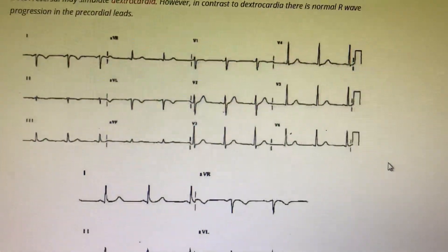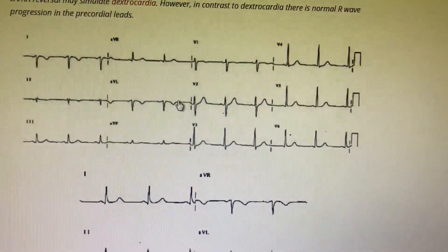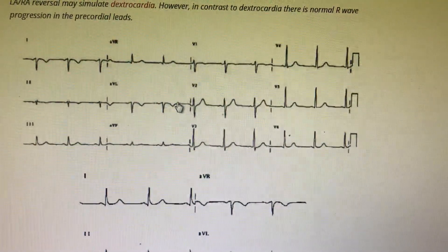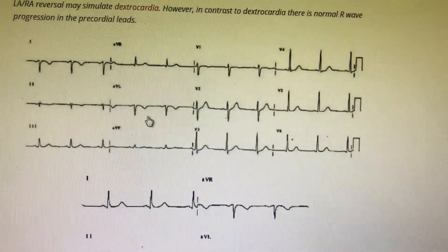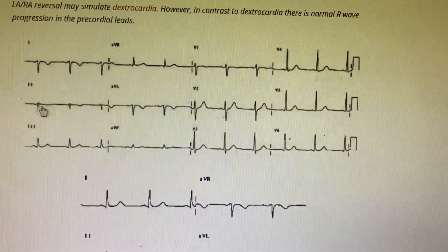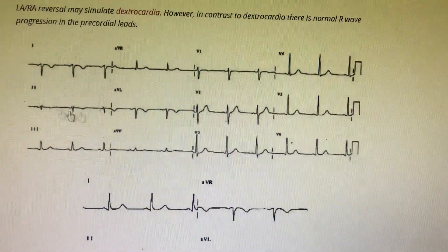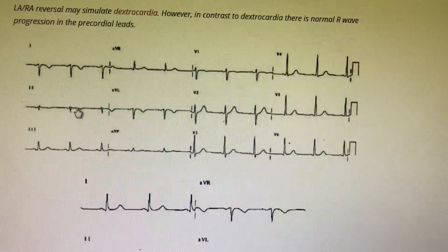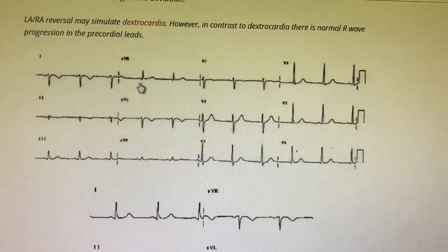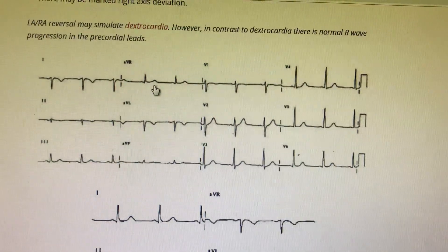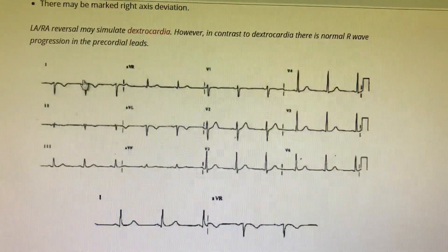We just discussed LA-RA misplacement — left and right arm lead misplacement. In this similar ECG, you immediately see that lead II is showing very low amplitudes. Then going to AVR, you see it is showing all positive: P is positive, QRS is positive, and T is positive. This gives a clear suspicion that something is going wrong.